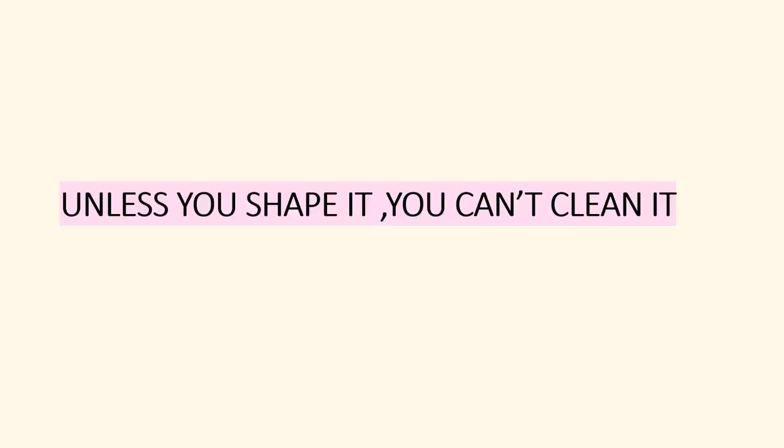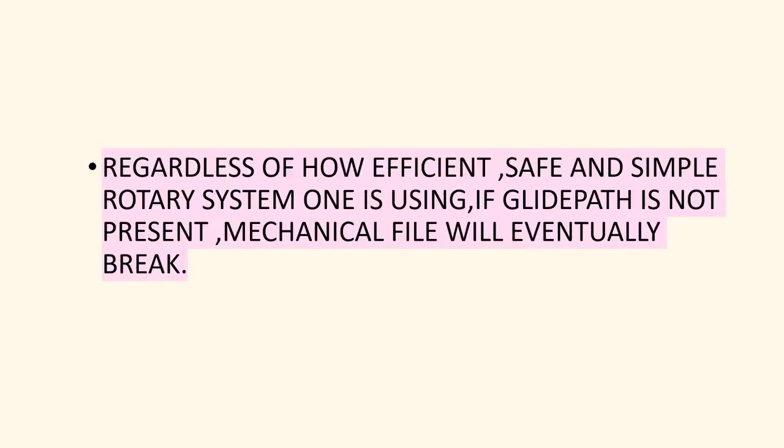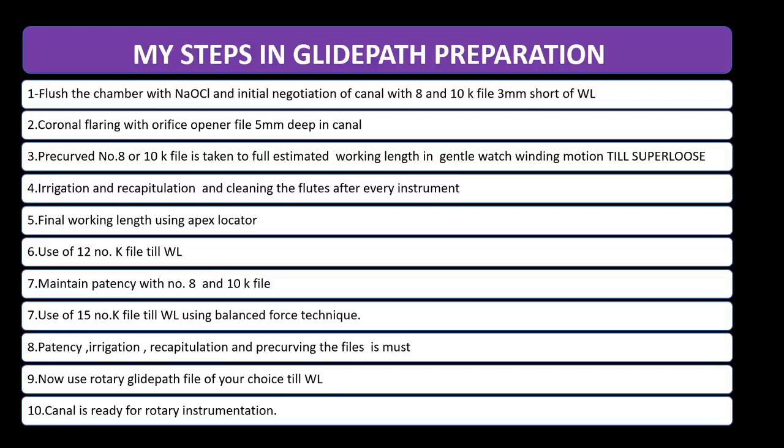Unless you shape it, you can't clean it. Regardless of how efficient, safe and simple a rotary system one is using, if a glide path is not present, the mechanical file will eventually break. And before concluding, let's sum up my steps in glide path preparation.